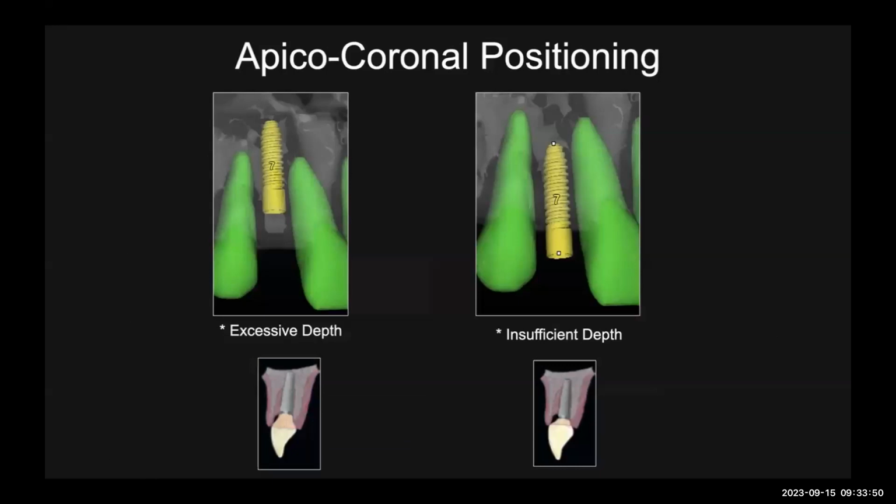So if we look at this critical and subcritical contour area, what problems do we have with it? Well, not all implants are placed at the ideal position. We know that the implant neck should be 3 millimeters below the free gingival margin of the adjacent tooth. That is ideal. How about if it is 5 or 6 millimeters below? Now we have an excessive depth, and an excessive critical contour. Same if it's insufficient depth. Now we can't build the contour because we don't have enough room.